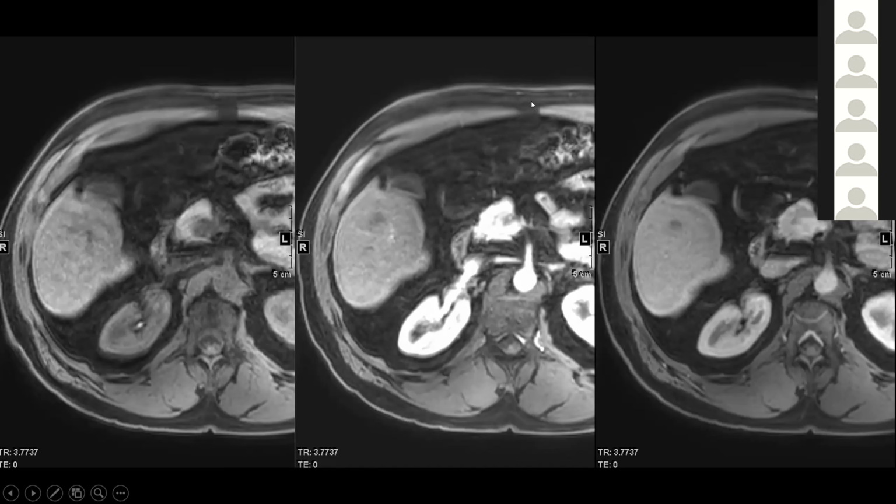And the debate started because on CEUS, you can reconstruct this curve even when everything is below the liver, because you're acquiring more data points more continuously. So in congruence with CEUS and the ultimate truth, can we provide some sort of guidance? We're still debating that.